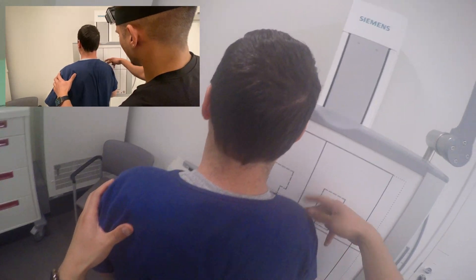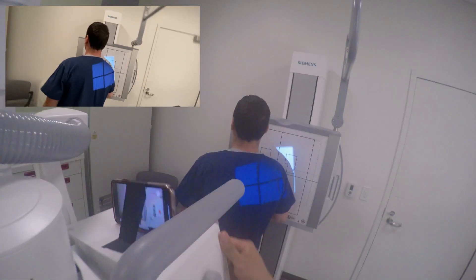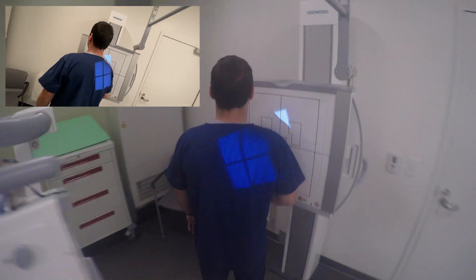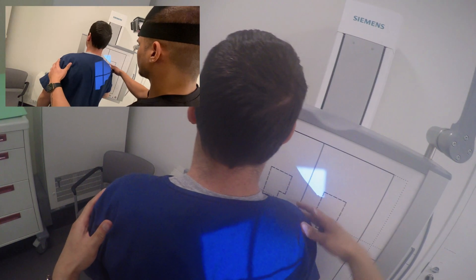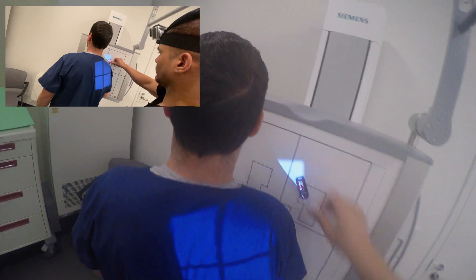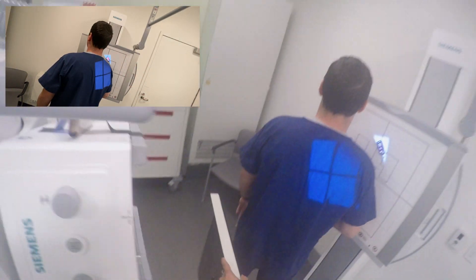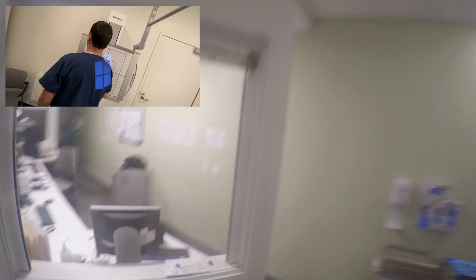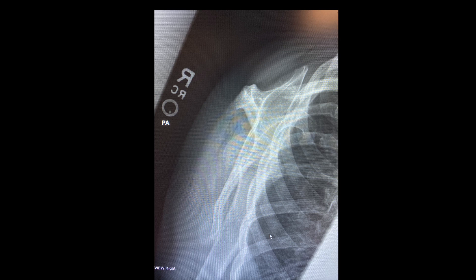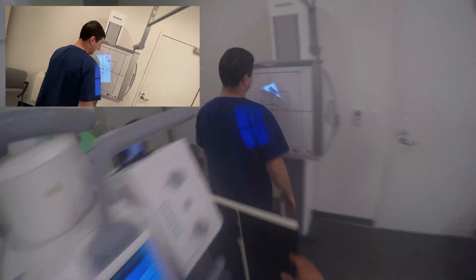And then we're going to go right there. Move your feet with you as well. Okay. All right, we're all done. Thank you.